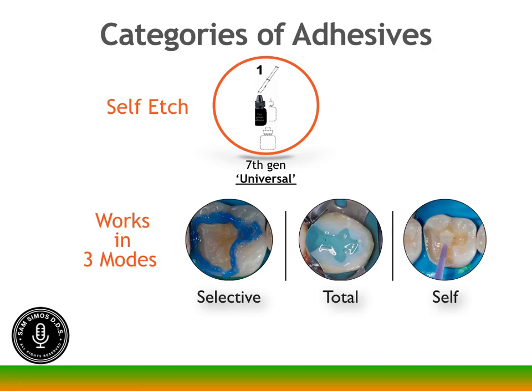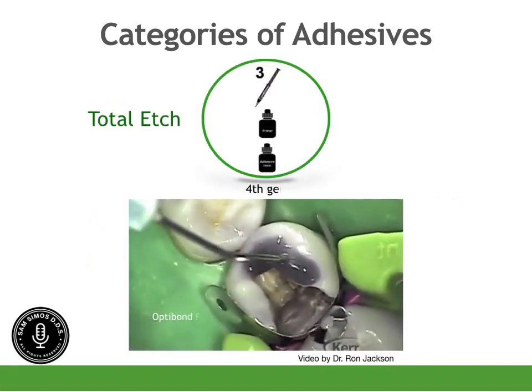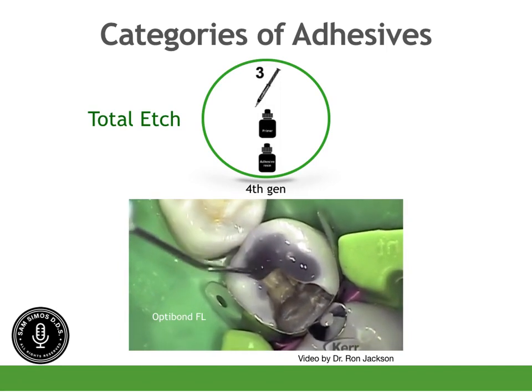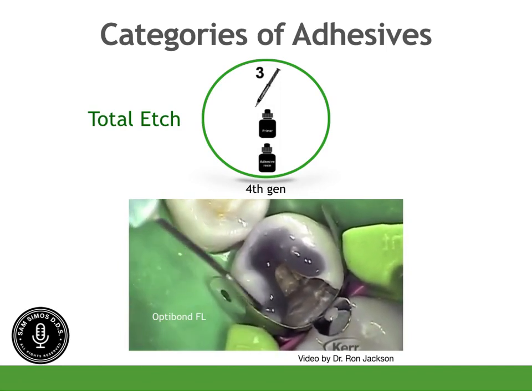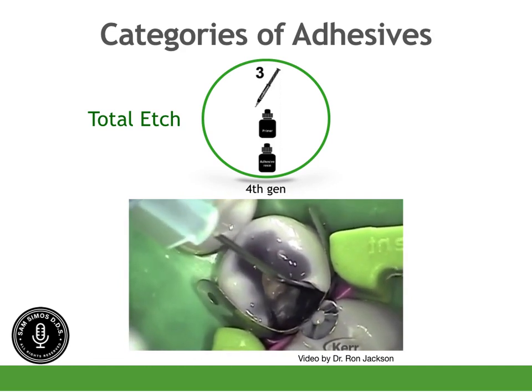I don't have to have multiple adhesives in my office. I can just use the seventh generation universal. So I'm going to give you a little bit of a taste of videos of how these are used. This video is by Dr. Ron Jackson. It's a three-part system.